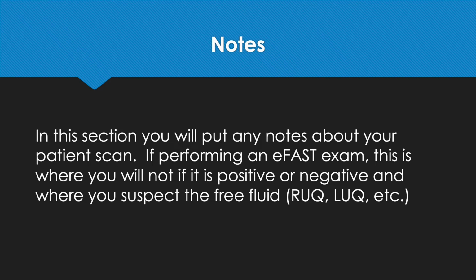And then any particular information you feel is important to that exam. If you had difficulty, if you couldn't find something, you couldn't find the kidney and the liver or you couldn't find Morrison's pouch, put it there, because that just lets us know, hey, okay, this is where we need to work on. This is where we need to focus some training on.